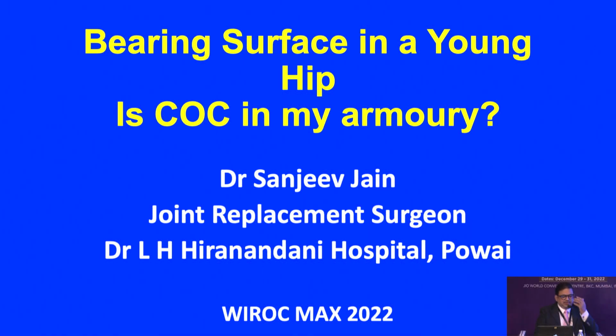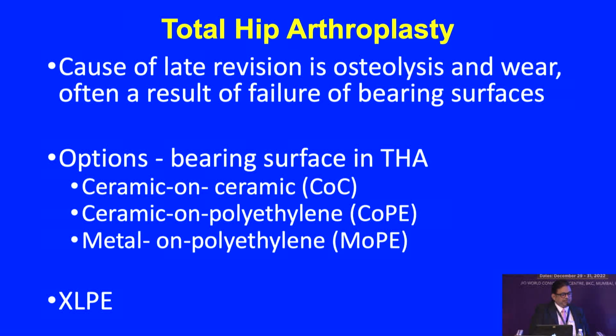So thank you so much. I'll be speaking on a COC, which is the preferred option, at least for me in very young patients. And then we are all aware of the fact that the osteolysis and wear is the major cause of failure because the bearing surface has a problem in the long term.